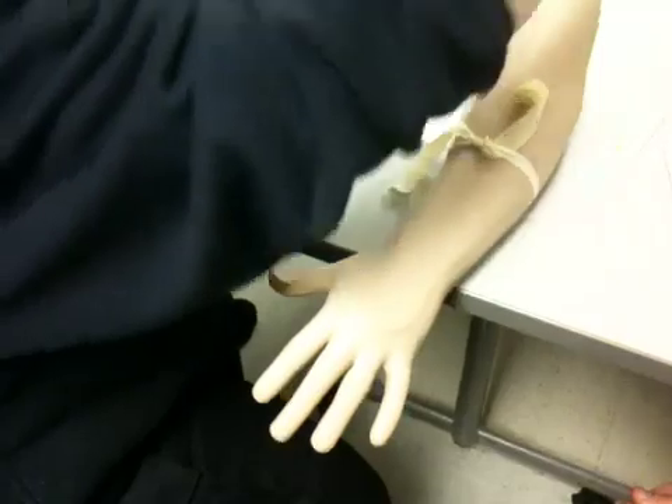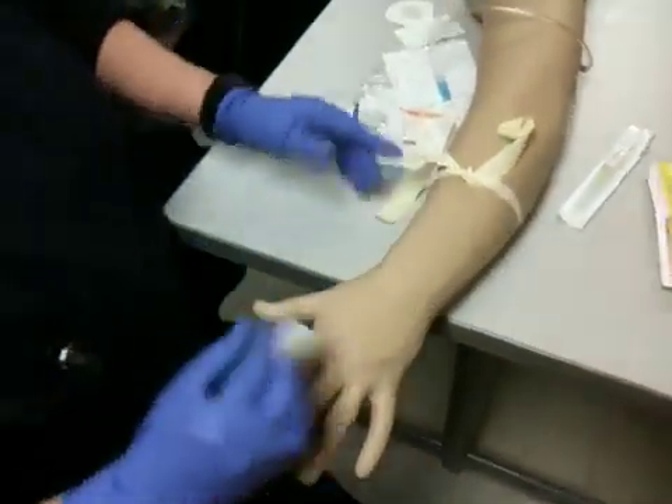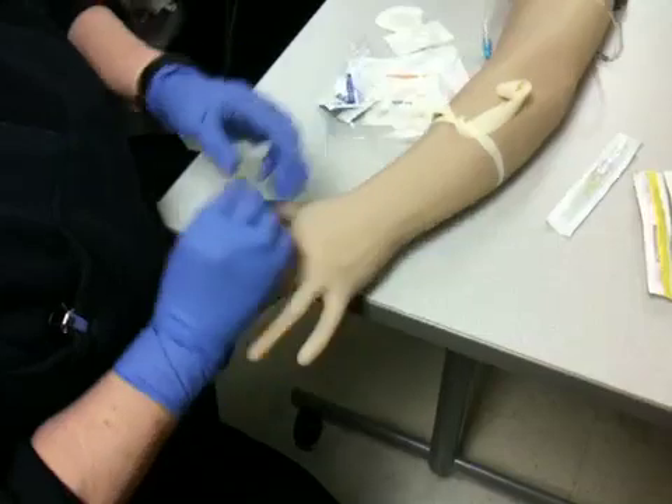Now, we cannot hold a tourniquet any longer than how long? Two minutes. Two minutes.